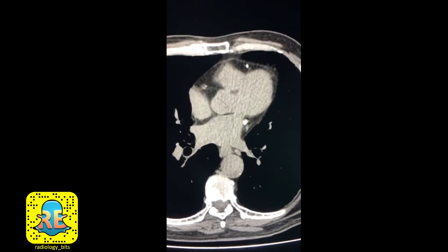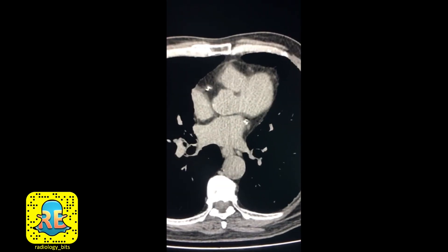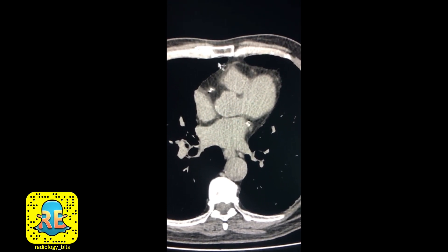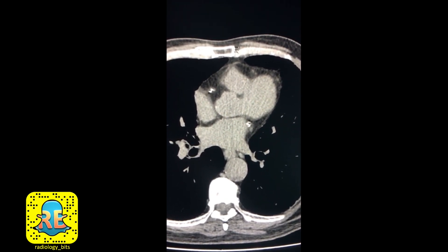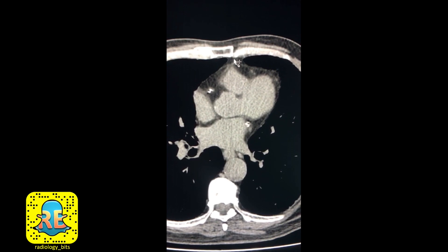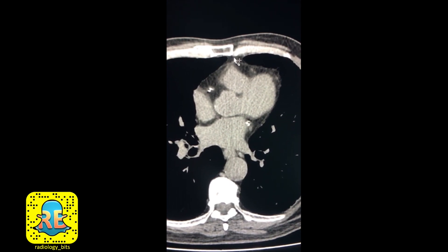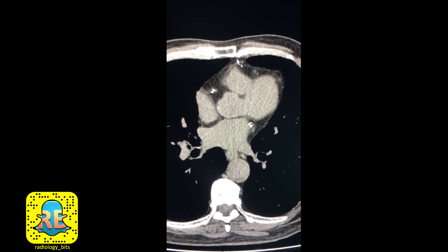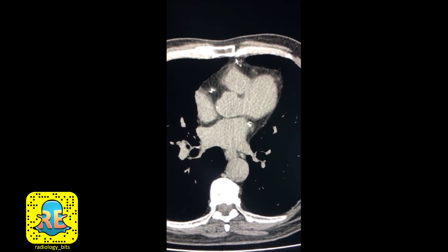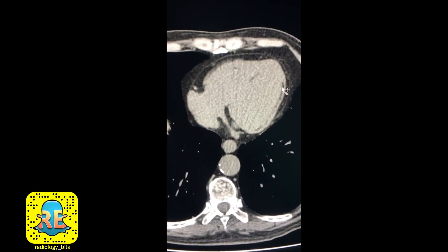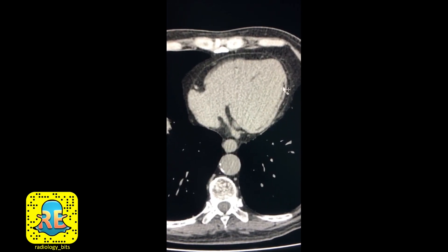For juniors, remember that calcium appears very bright in a similar fashion to bone — that's a basic rule you can apply to CT or X-rays. So calcium and bone are bright.